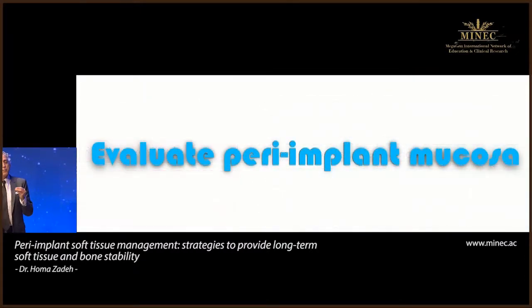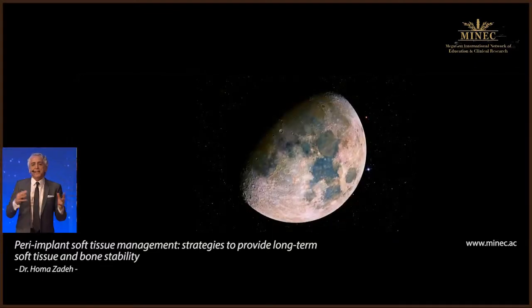With that, I just want to urge you that as you evaluate implant sites, we all have been trained to evaluate bone. Everyone takes a CBCT, everyone does 3D imaging, but now I just suggest to you that in addition to evaluating the bone, evaluate the mucosa for its adequacy to undergo bone implant placement. If necessary, include that in your initial plan, avoiding the problem.